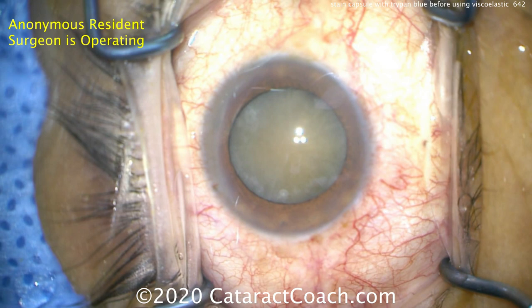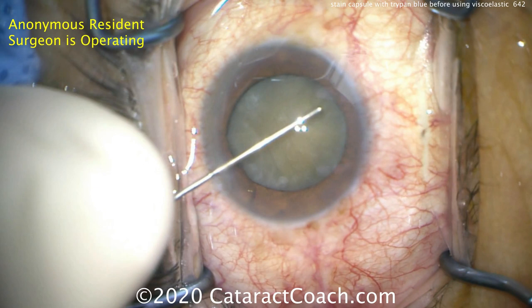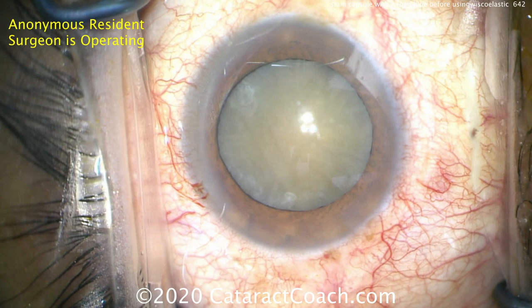We have an anonymous resident who's operating. This cataract is very dense, very opaque — there's no red reflex. Here's a nice full fill of dispersive viscoelastic being used to coat the endothelium, protect the cornea, and give the anterior chamber some depth. That looks great.